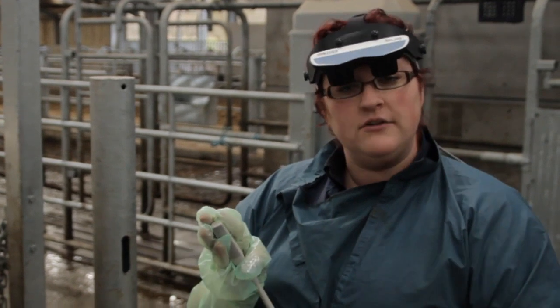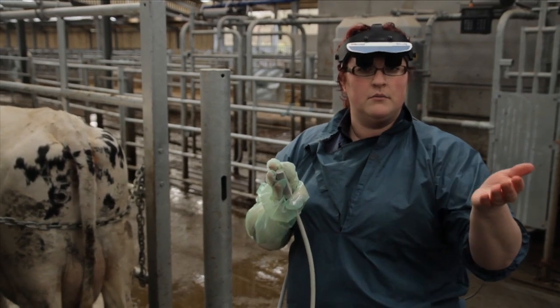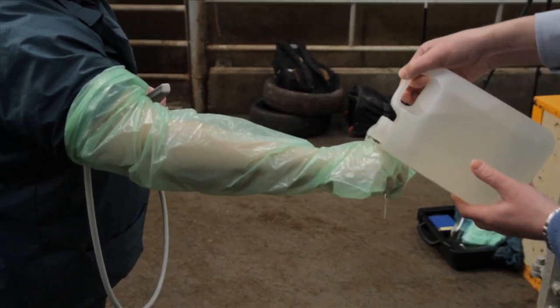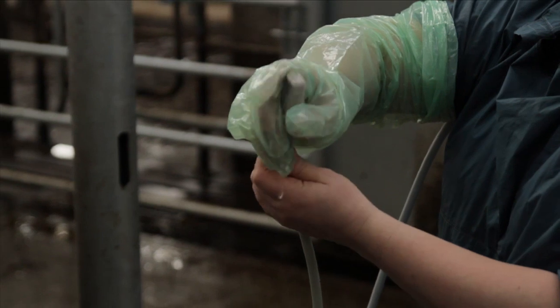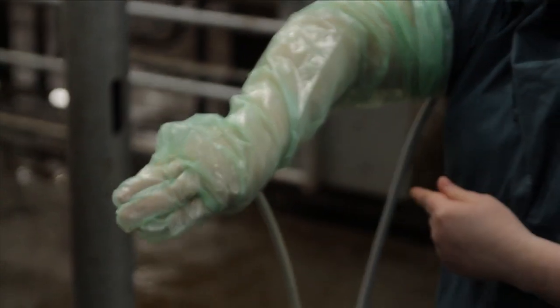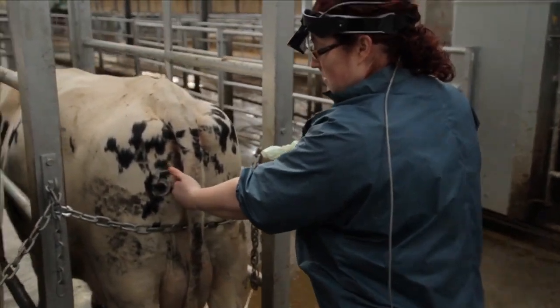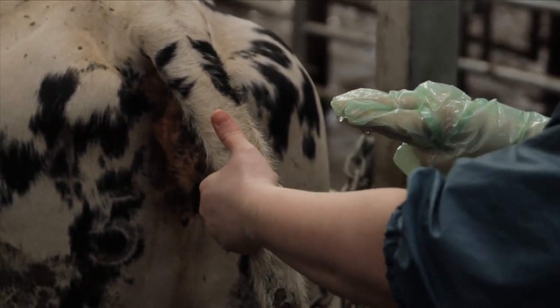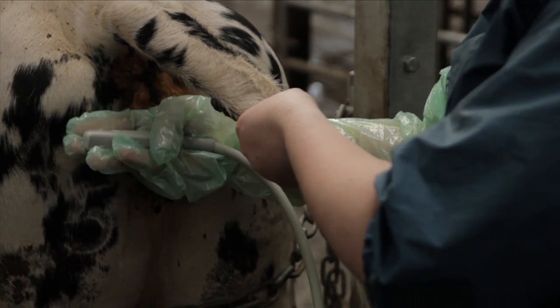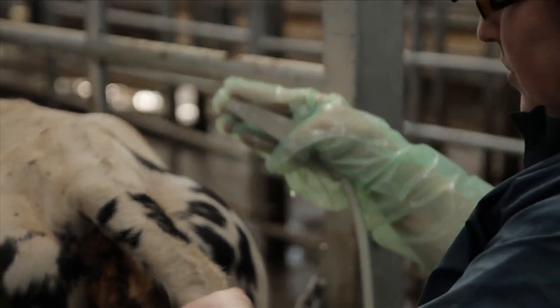We will need to use gentle handling techniques, just as you would with manual palpation. So we'll get some ultrasound lube, and I've put that both in my palm and also on the back of my hand. We'll cover the surface of the probe, and we'll use what's on the back of our hand to lubricate the cow. Gently grasp the tail. Use the back of your hand. It's all right, girl. And closing your fingers around the end of the probe.